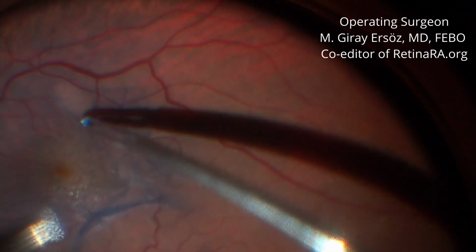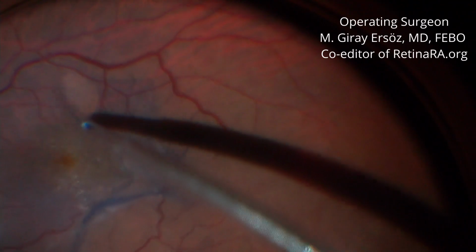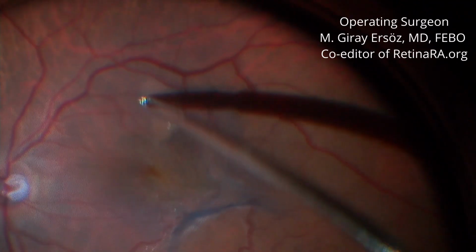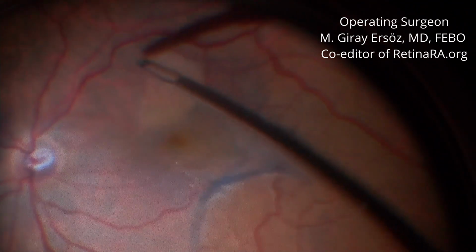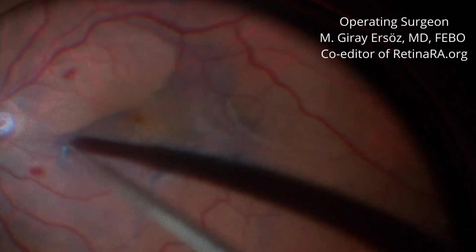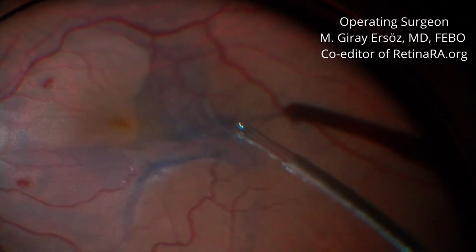Guided by the OCT findings, my surgical strategy was to initiate membrane peeling from the side opposite the region of pre-existing inner retinal damage. If I had initiated peeling from the free edge of the membrane, I would have caused iatrogenic peeling of the retinal layers along with the membrane, because there is a firm adhesion between the ERM and the underlying retinal layers at the free edge.